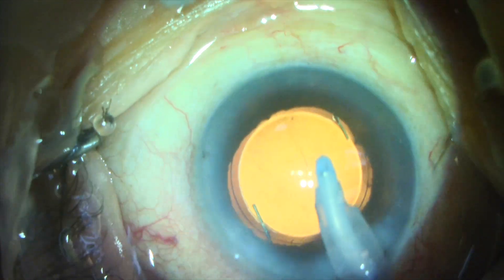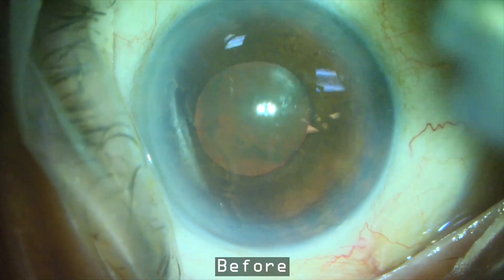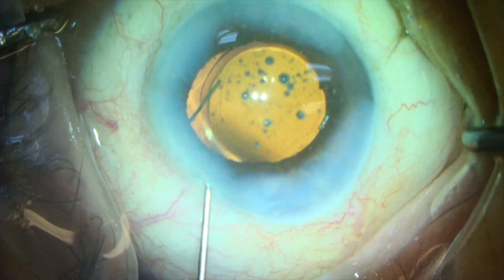This patient did well, and this is what the eye looked like at the conclusion of the case. I hope this video was helpful, and I hope you'll consider using this Inamura pre-chopper. Thank you for your time and attention.